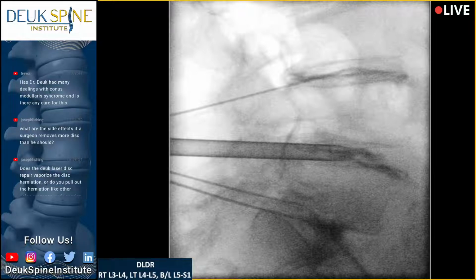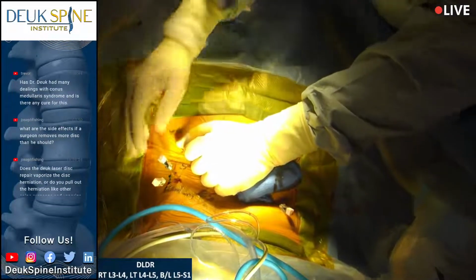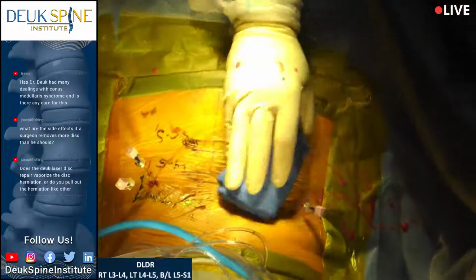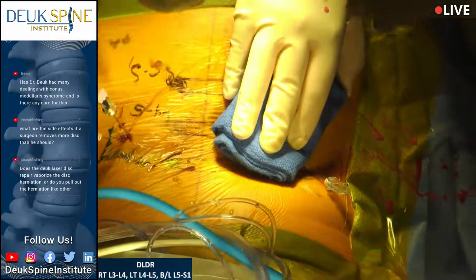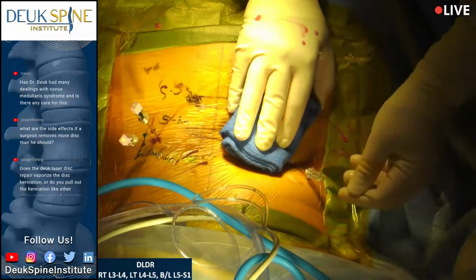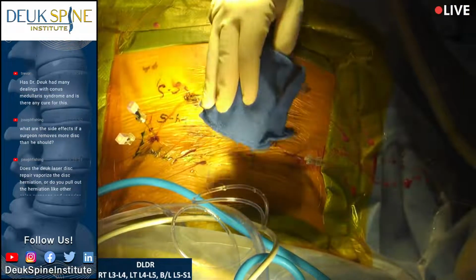All right, it's important to apply pressure when you take the tube out because you've basically spread the muscles open and you want to make sure there's no bleeding that's happening. So sometimes bleeding can happen inside the patient and you won't see it. So it's important to apply pressure even if you don't see bleeding. And make sure you hold it just for a few minutes. And that way if there is some bleeding, it's small bleeding, it stops quickly. All right, shot.